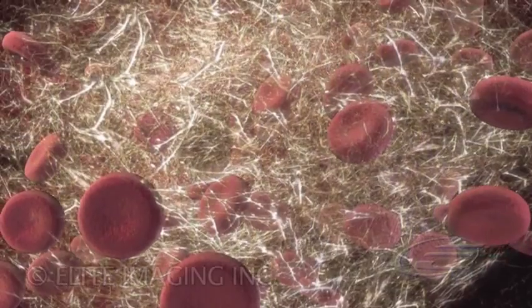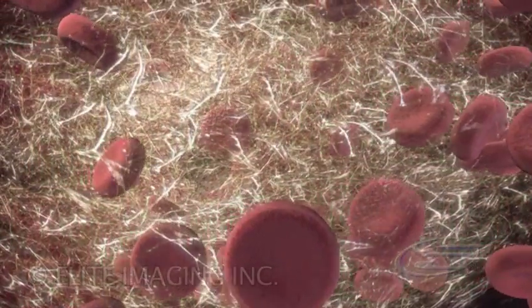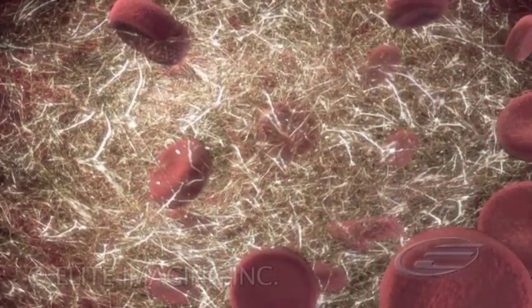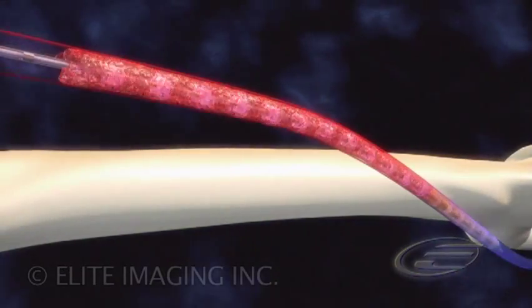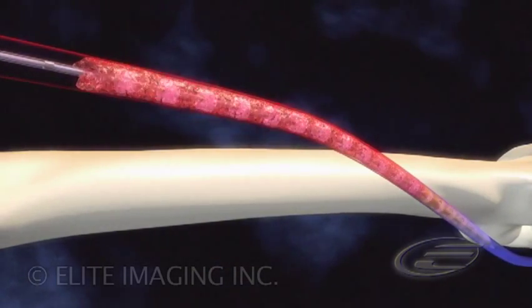As fibrin strands dissolve, red blood cells and other blood components trapped in the fibrin matrix are released into the blood. The lysis system simultaneously delivers drug and ultrasound energy along the entire length of the clot.